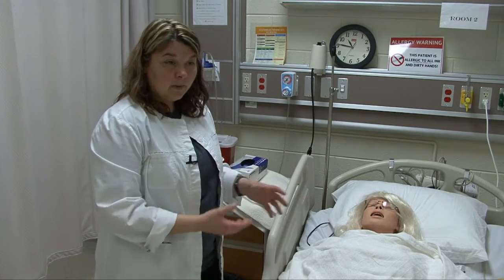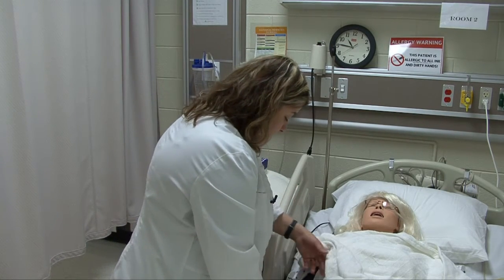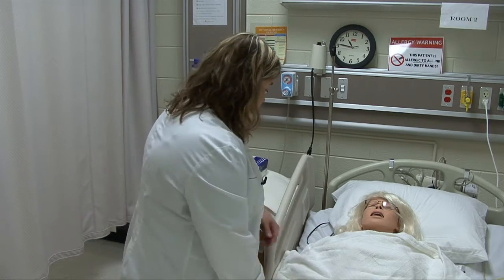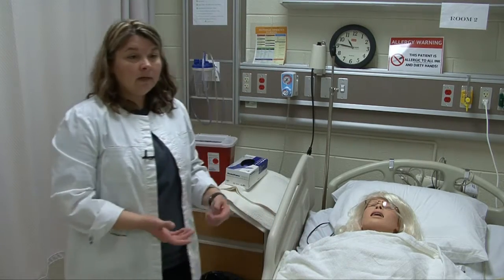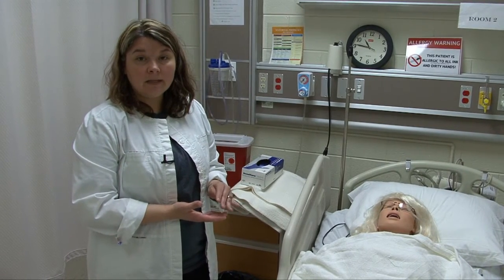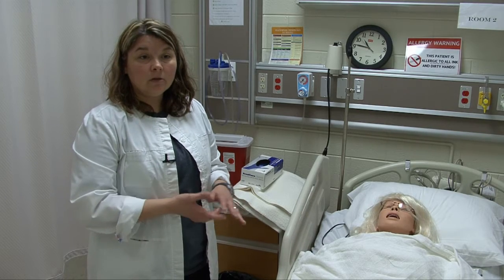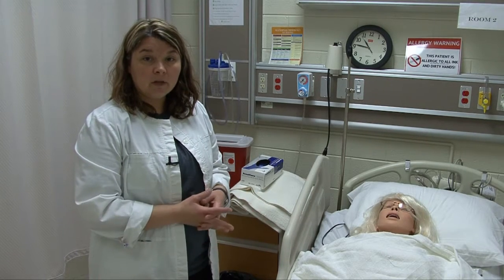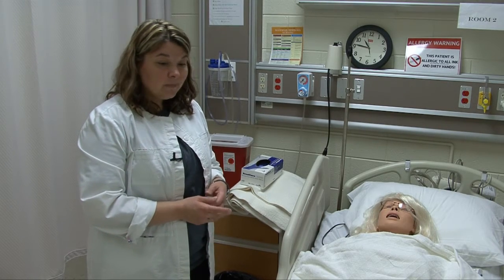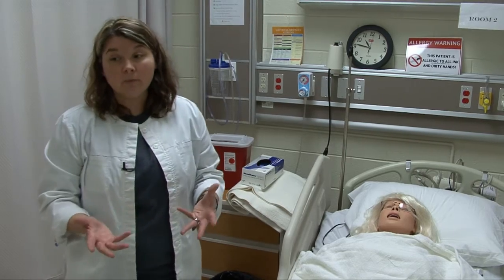You always want to ask if your patient has any allergies, and then identify the patient. Can you please tell me your name and date of birth? I'm doing that while I'm looking at her armband, and she confirms it. Before entering the room, I would verify the doctor's order and confirm it fits the patient's situation — that there are no contraindications. I've confirmed all of those things and I brought some equipment with me.